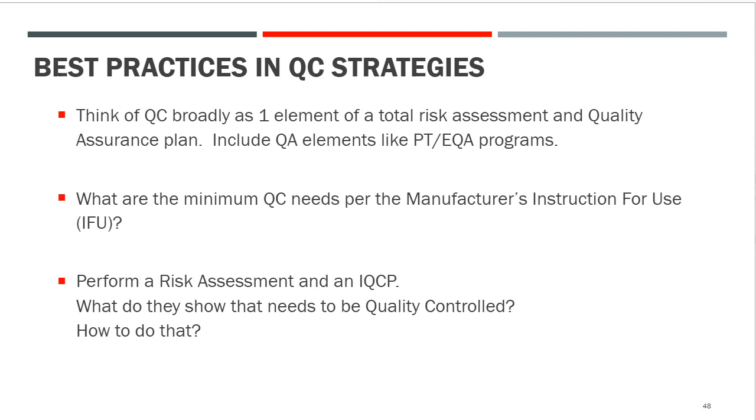Perform a risk assessment, please, and an IQCP, an individualized quality control plan. What do they show that needs to be controlled? They may show that some things don't need to be controlled. And how do you go about doing that? Understand the total laboratory picture, the total laboratory processes, and where the risks are.